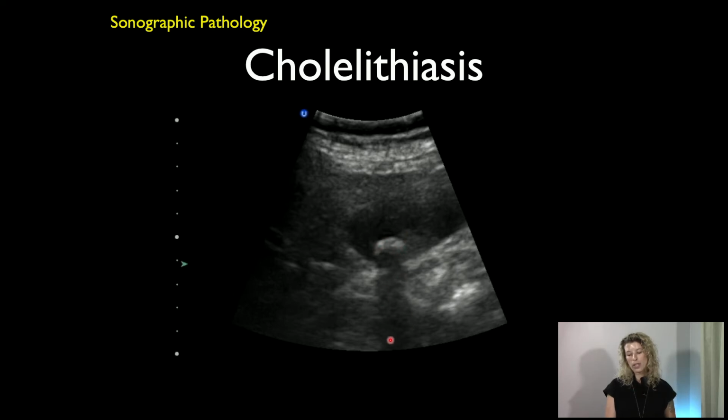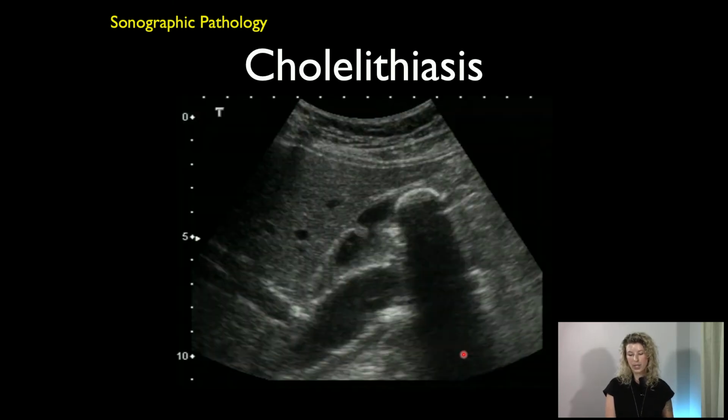And if you notice, and it's important because I'm going to show you some clips of small bowel, which has what we call dirty margins, dirty shadows, just notice how linear the shadow margins are. Here's a nice big whopping stone. The shadow is really dark. It has very clear borders.